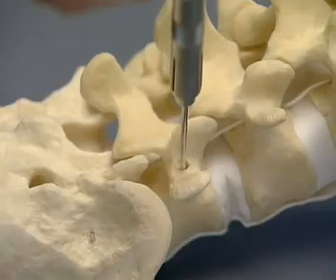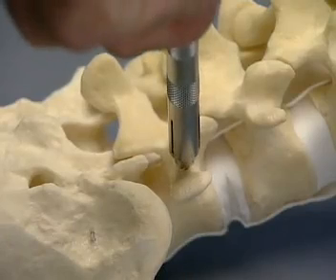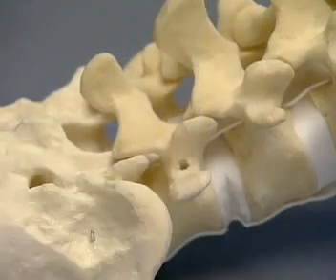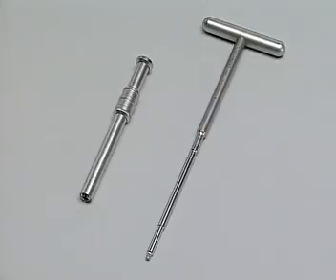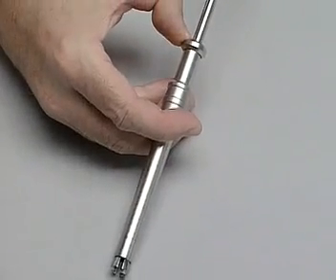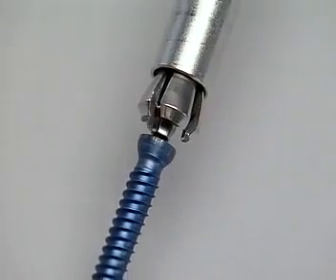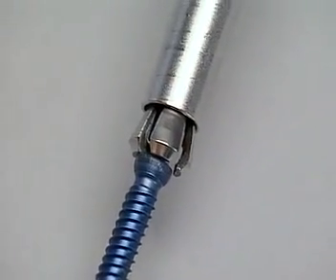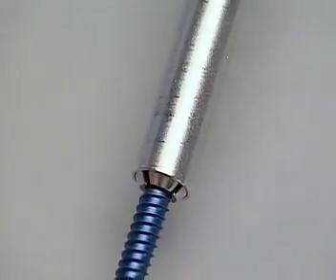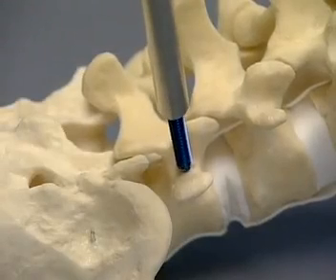The depth of the pedicle is measured, ensuring at the same time that bone surrounds the pedicle hole. A screw of the appropriate length is inserted using the T-handled hexagonal screwdriver and the holding sleeve. As the pedicle screw is inserted, the holding sleeve is released.